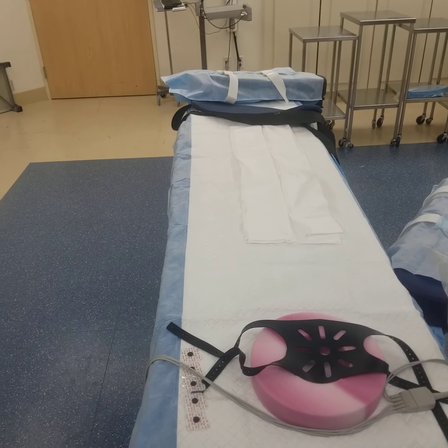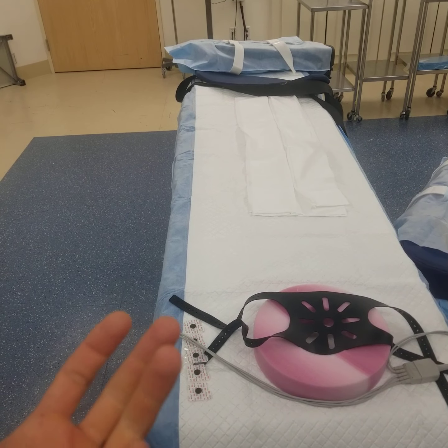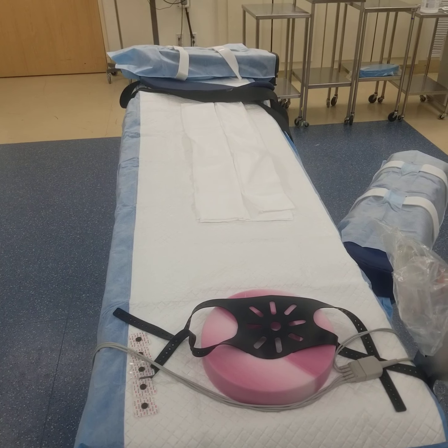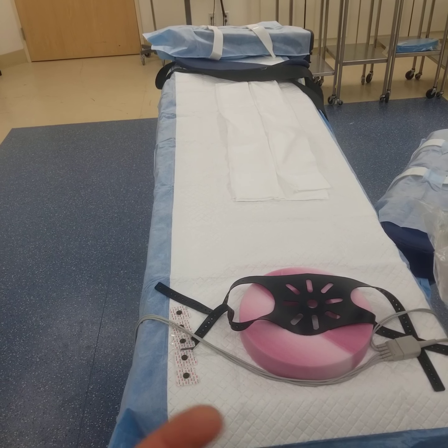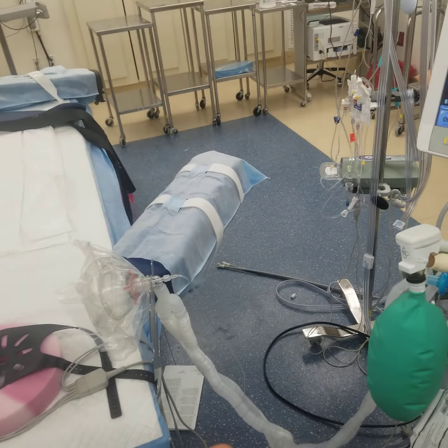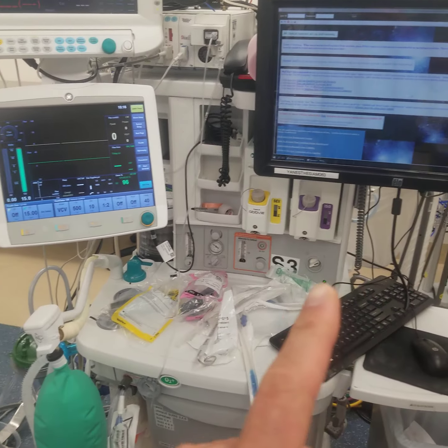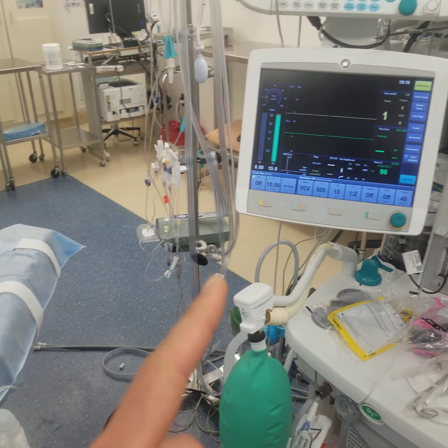Pre-meds should be for people who are obviously anxious. They benefit from a little bit of anxiolytic like Versed. So give maybe 1 to 2 milligrams depending on the patient. Some might need more. And as you age, you might need a little bit less. So as far as putting vitals on, the next thing you want to do is you're recording on Epic. So you want to now start to hook up your vital signs.